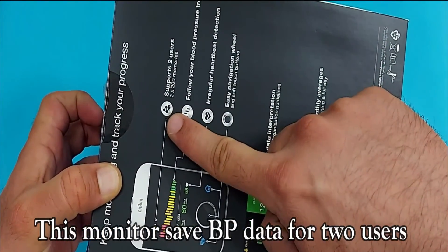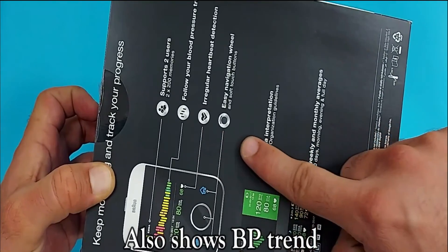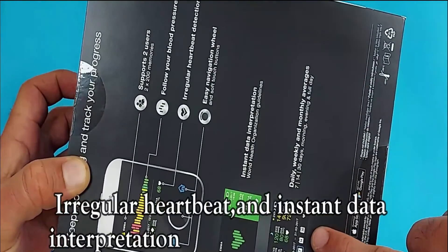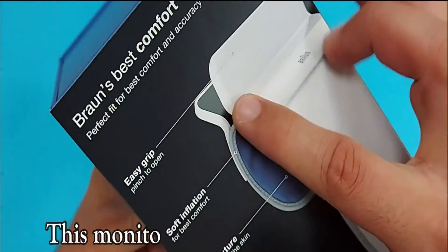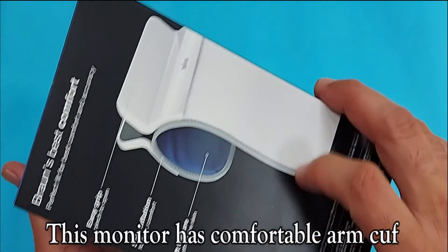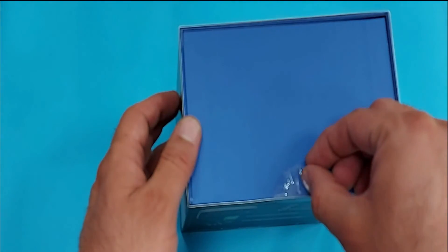This monitor saves BP data for two users. It also shows BP trend, irregular heartbeat, and instant data interpretation. This monitor has a comfortable arm cuff, and there is also built-in Bluetooth.